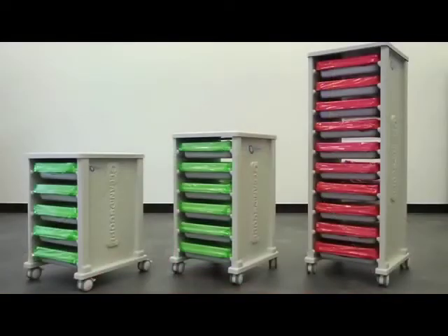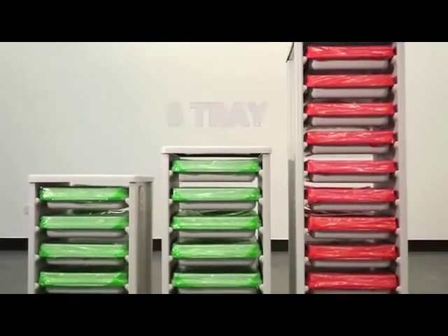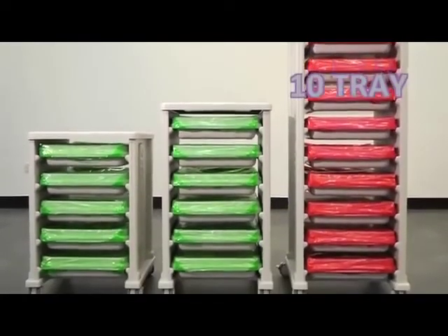The Cleanerscope transport carts come in several sizes: a 5-tray cart which fits under most work surfaces, the most popular 6-tray cart, and the 10-tray cart recommended for storage in the reprocessing room.